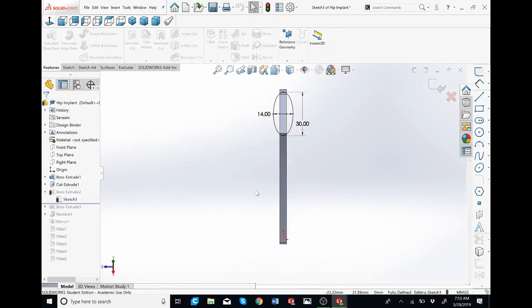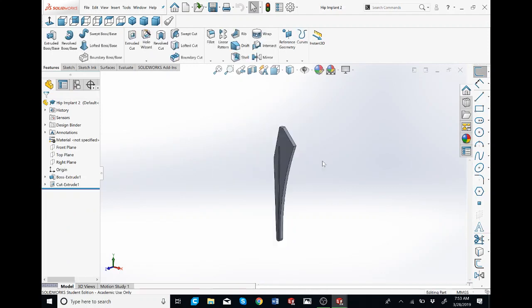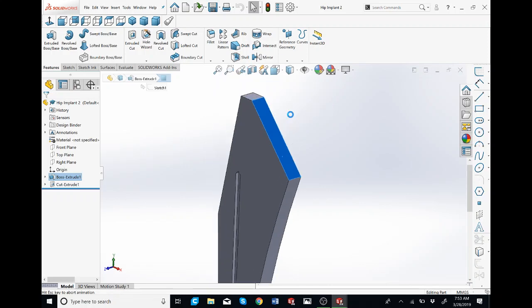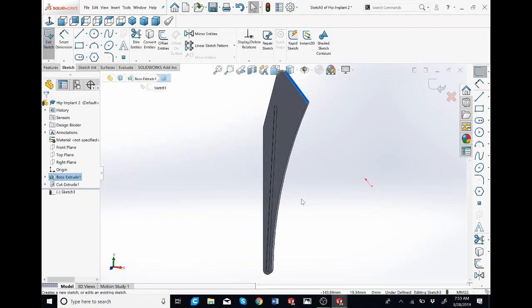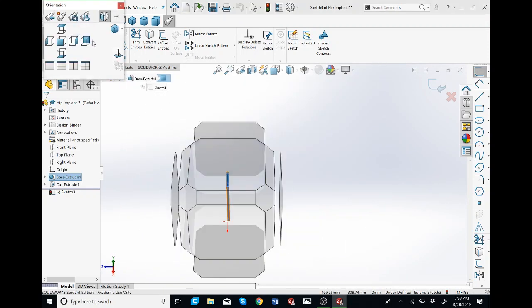So going back to the master model, I made an ellipse 30 by 14 and we sketch on this face over here. So I'm going to zoom in, click on this and then sketch. I have my setting set so it automatically goes normal to the face. So let's say you're over here, just press Control 8 and then it goes back to it. You can also press the space bar and then you have all these views that you can choose from. And you hover over them, you can see that it shows you the shortcuts for them.